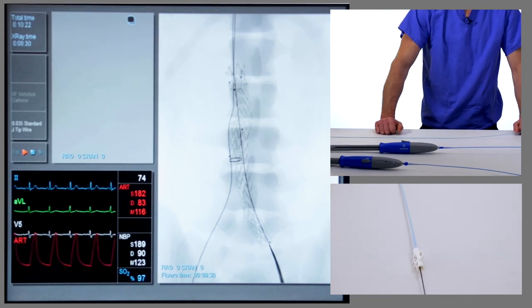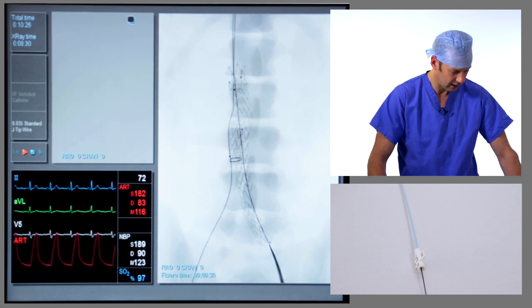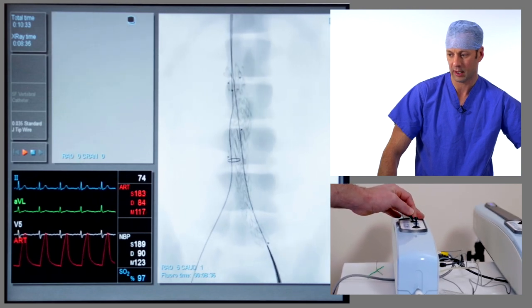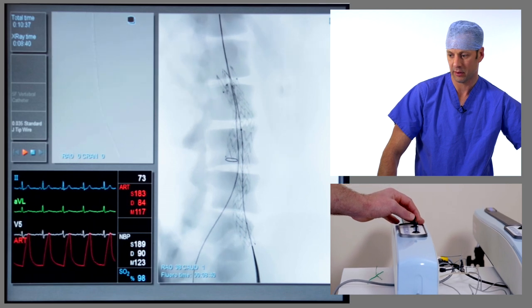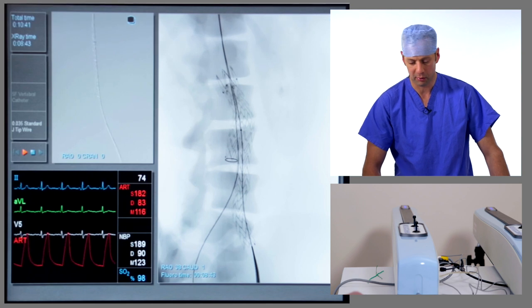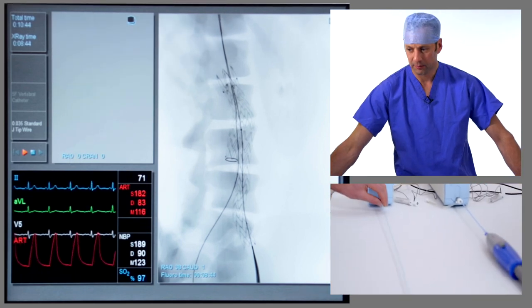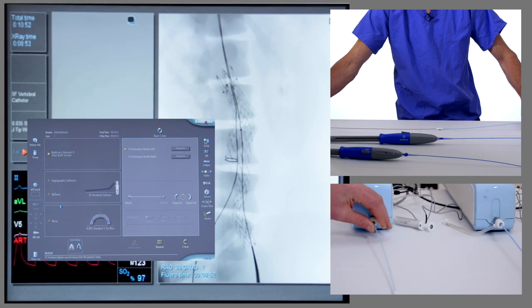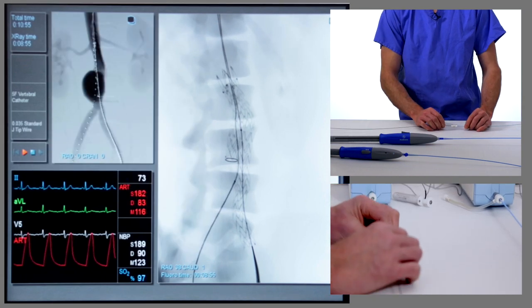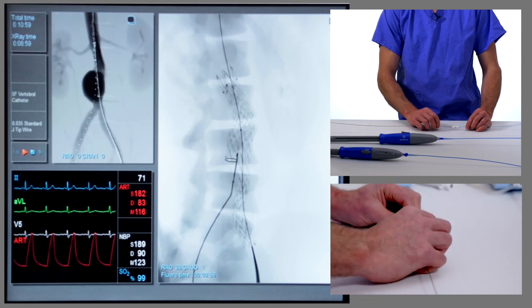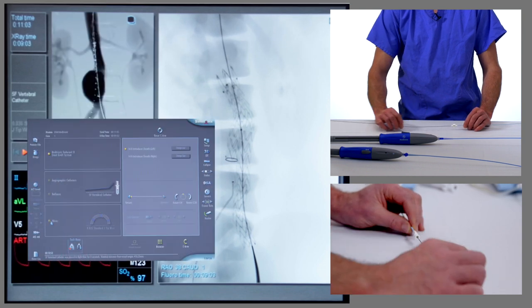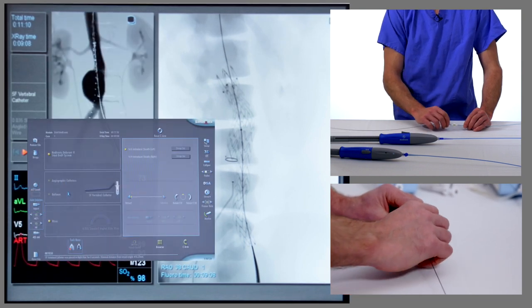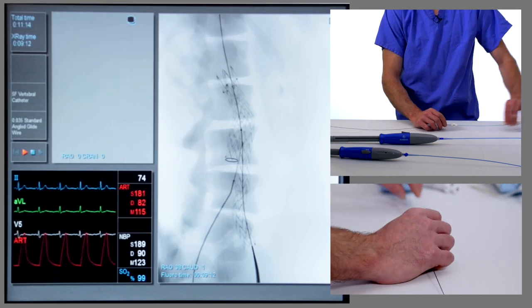We haven't opened the two limbs quite perfectly side by side, so to work out the orientation we can just angle the C-arm a little side to side until we see the gate fully open. We're in the right anterior oblique, which means the limb has opened slightly posteriorly. We advance the vertebral catheter, remove the J-tipped guide wire, and replace it with an angled Terumo hydrophilic wire, passing that back up through the vertebral catheter to try and access the contralateral limb gate.